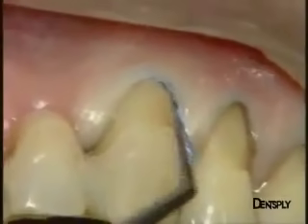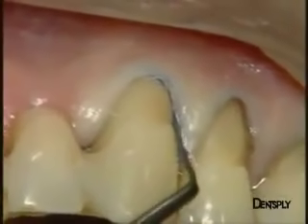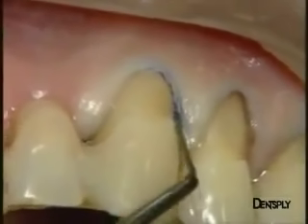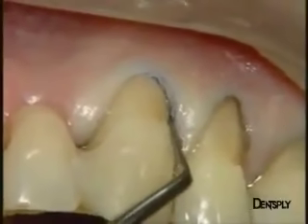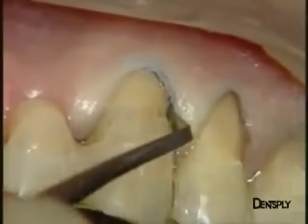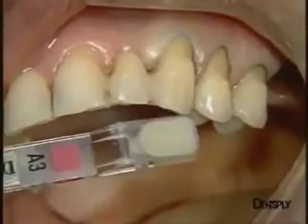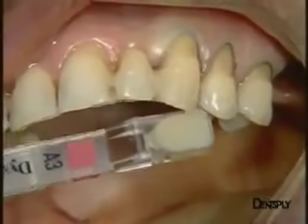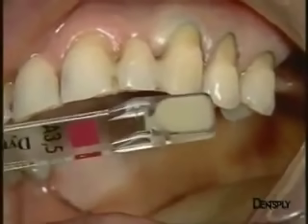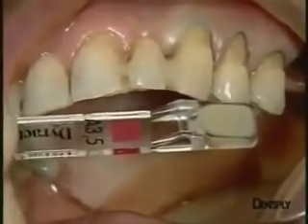Here is the last preparation on the most mesial tooth, the canine, using our cord that we must insert carefully to avoid any bleeding. The shade is selected and, by looking at the natural teeth, we can see that the canine is more pigmented than the premolars. We selected shade A3.5 for the canine and A3 for the premolars of the Dyract Extra material.